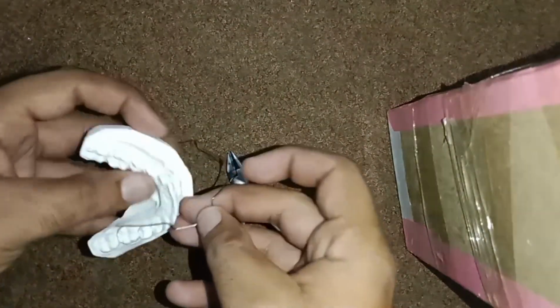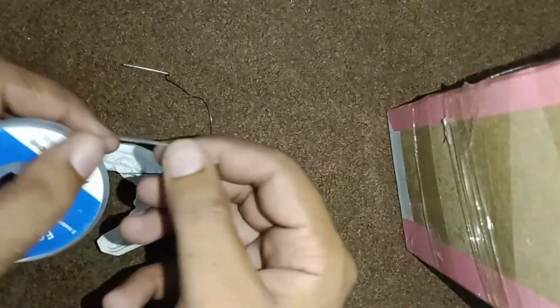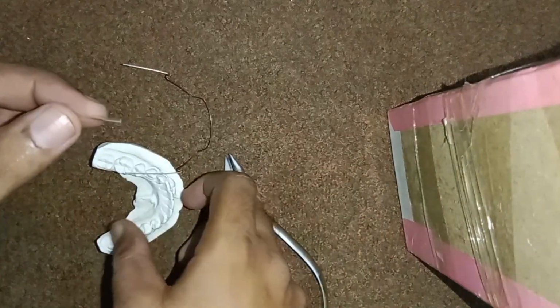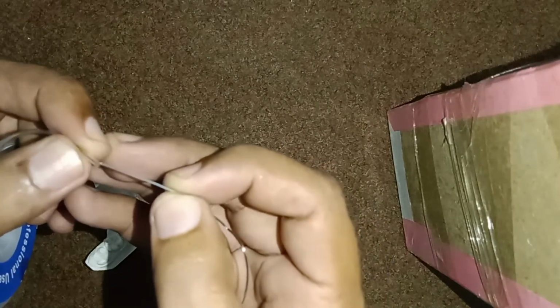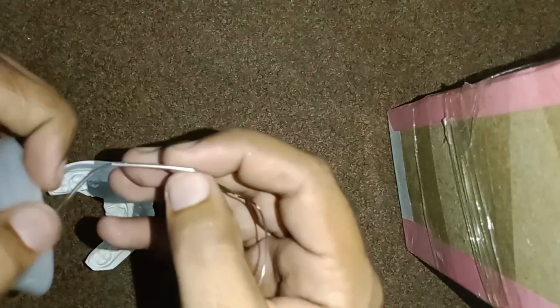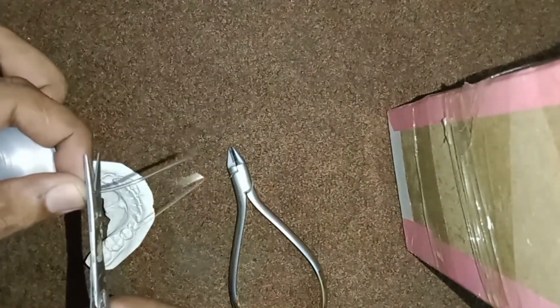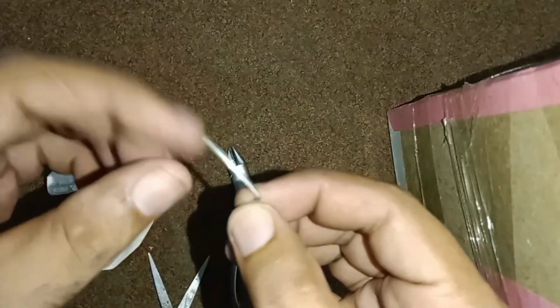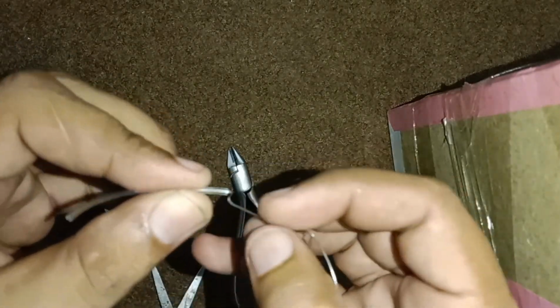In order to make it more comfortable for the patient, this is the piece of archwire sleeve which was used in the initial segment to cover the wire when it was bypassing these incisors. We can pass this wire into the archwire sleeve.